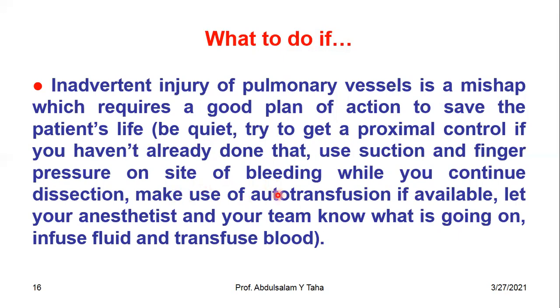Make use of autotransfusion if available. Let your anesthesiologist and your team know what is going on. Infuse fluid and transfuse blood, and so on. So this is one of the serious complications that you have to deal with carefully. Otherwise, you may end with a disaster. You may lose your patient.